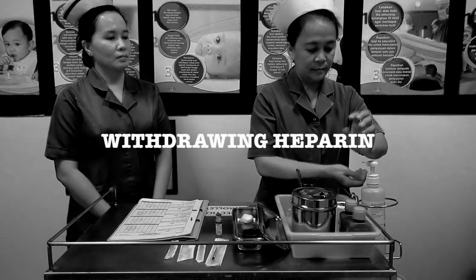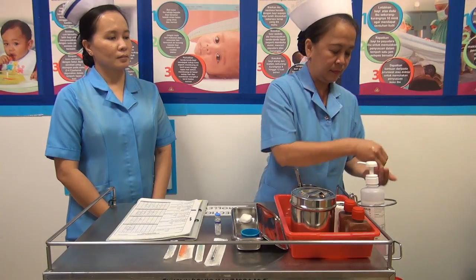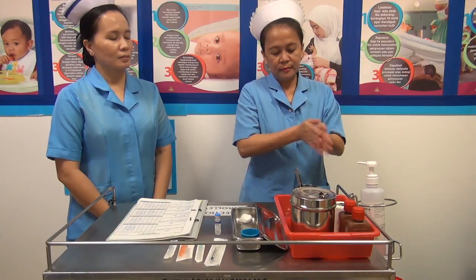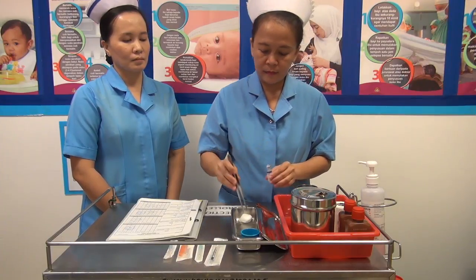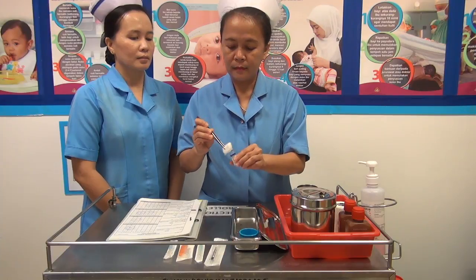Withdrawing the heparin. Preparation and administration of heparin should be done using aseptic techniques. To withdraw the heparin, first open the cap of the vial and clean the top of the vial with an alcohol swab.